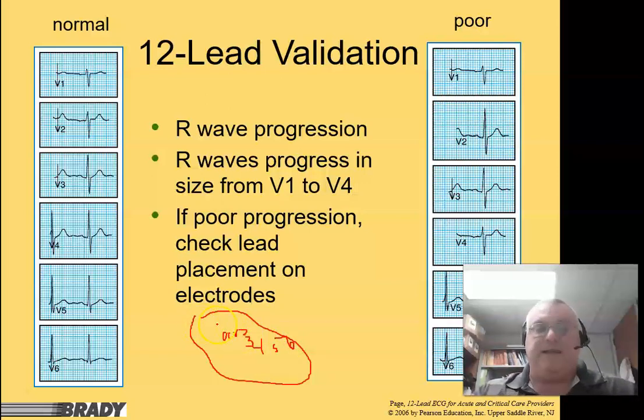If you stop and think about it, it's got to go through a lot more. It's closer to this guy right here, okay? And remember, the machine only reads the amount of voltage towards the positive pole. So depending on where the negative is, it's only going to read it up to that point. So it's going to start small here and get bigger.